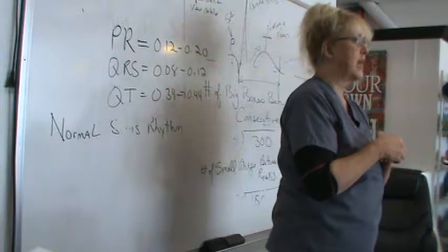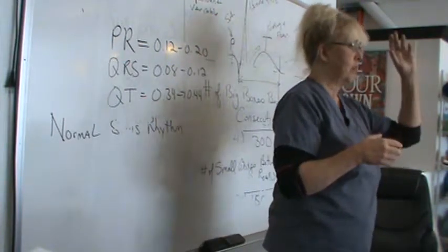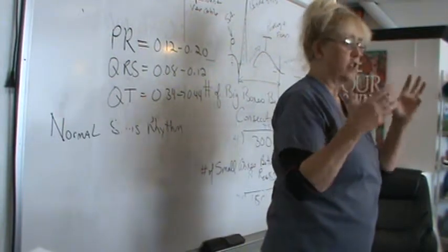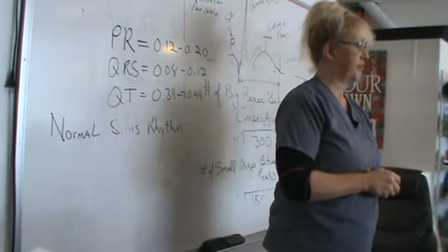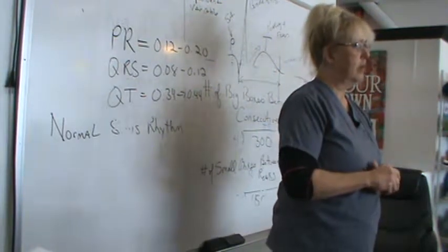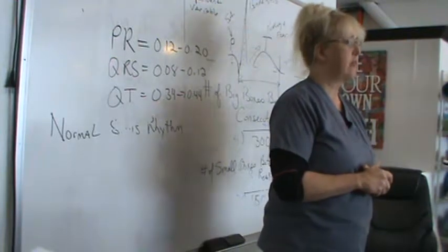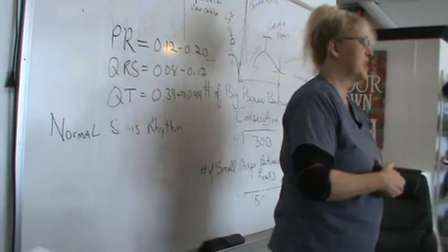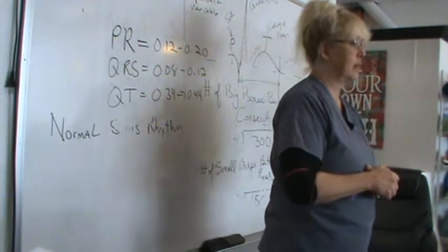A lot of hospitals haven't determined what a limit is, but obviously if you have multiple people degrading into different life-threatening rhythms, you're going to be all over the place, right? So studies need to be done with regard to the safe amount of people that one telemetry technician can watch at one particular point in time.